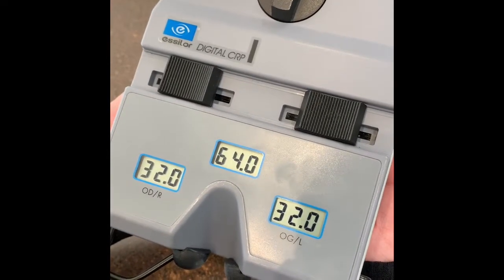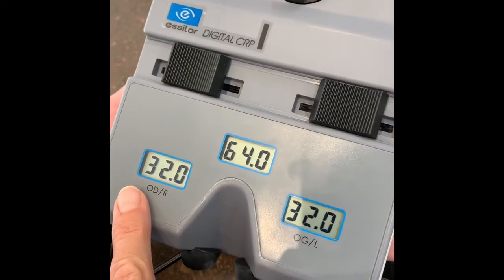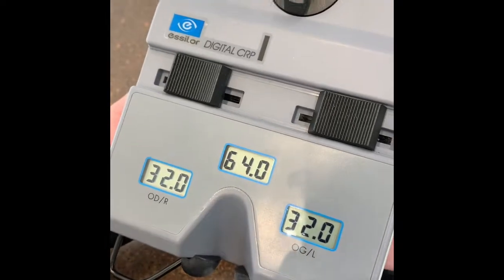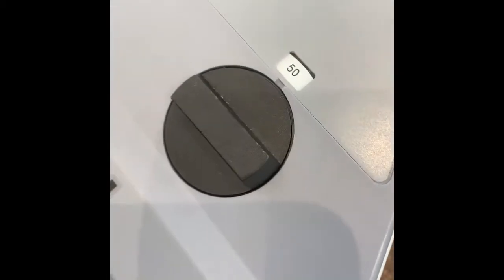Most people are going to have very similar measurements between the two eyes — monocular left and right. The setting here is for reading. You can also test it for computer.